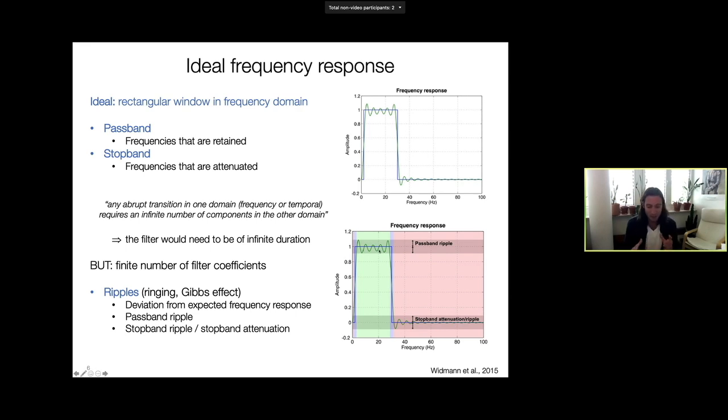So even in the frequency bands which we analyze later on in our EEG analysis, there are some deviations. And no matter whether you filter on continuous data or on epoch data, you're always going to have those deviations from the signal in there. You should always filter on continuous data.